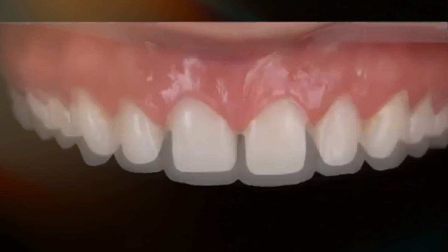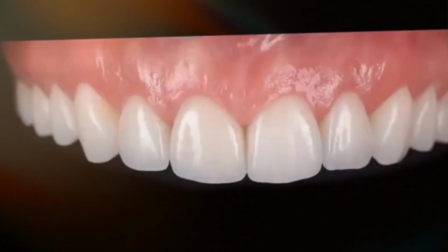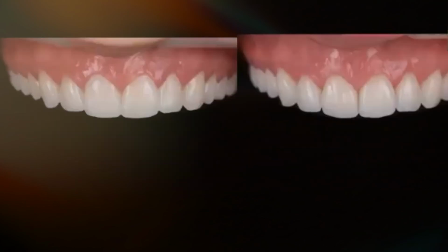Now, if the case is additive, it's worth doing this. If the case is reductive, you don't even need to go through this step. Then clinically, you need to do everything according to what you plan. So you need to recontour the tissue, prep the teeth according to these things, and then you can be very predictable in milling monolithic restorations that copy the shape, exactly what you chose, staining it a little bit, and we know already that this can be very predictable. You can see the design in PMMA in bisacryl on one side and in ceramics on the other. And this works very well in an ideal scenario.